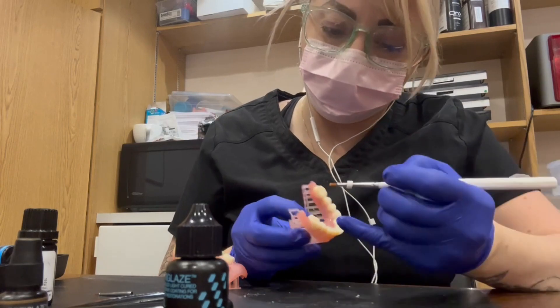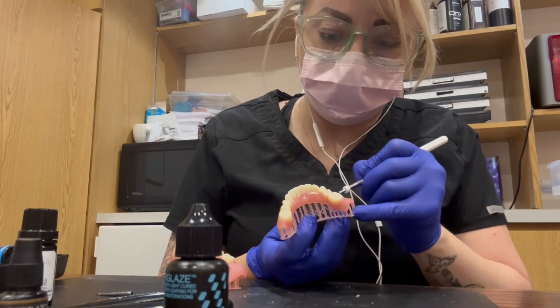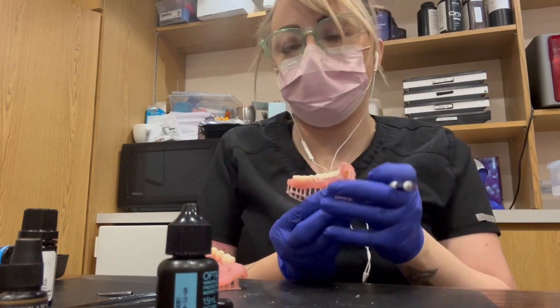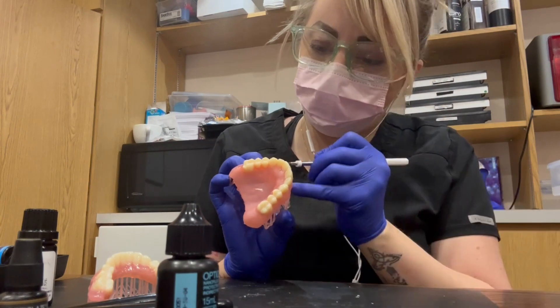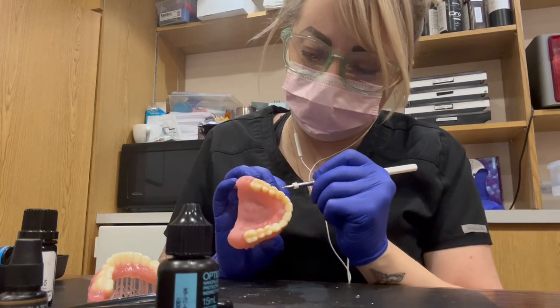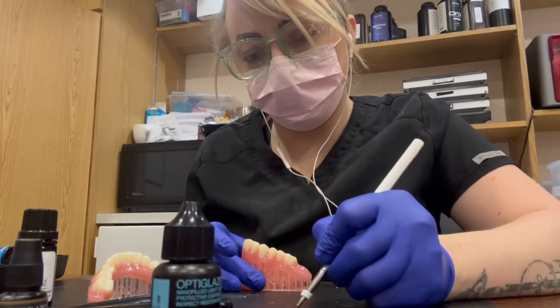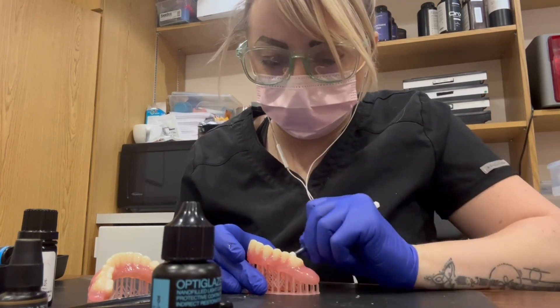I like going all out with lots of characterization, but this patient in particular just wanted something very simple, so we did just that. We put a little bit of olive in between the teeth, a teensy bit of blue on the incisal, and then just a clear glaze all over — and the patient was really happy with these. They might not be her final depending on how much she changes while healing, since they were immediate dentures, but we were very pleased with these.